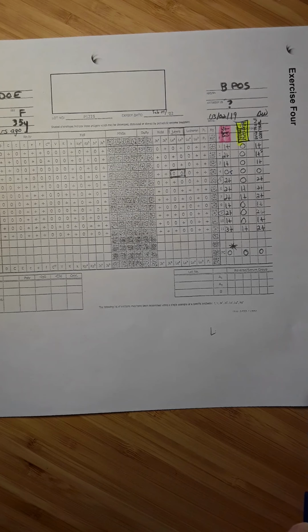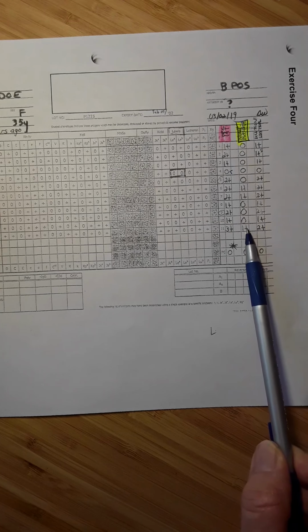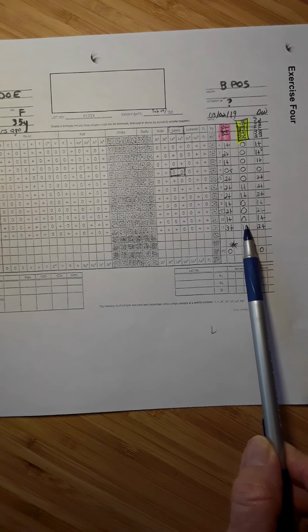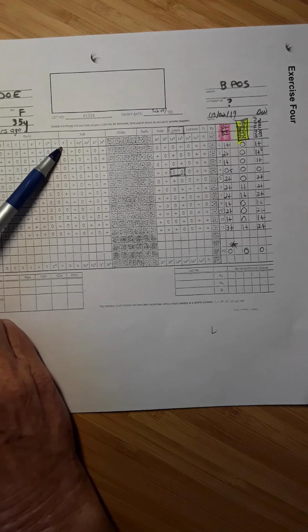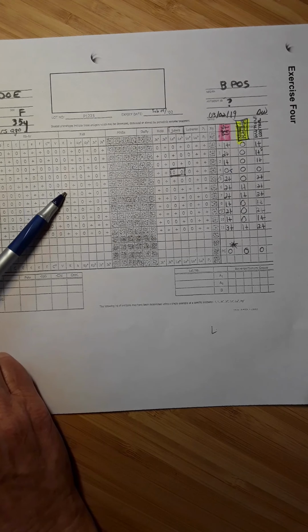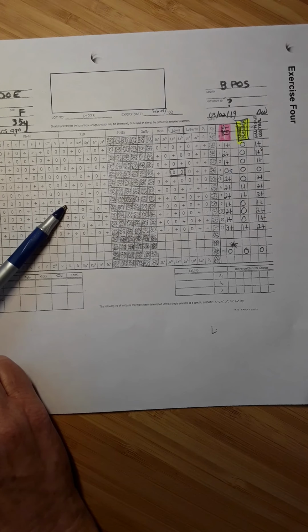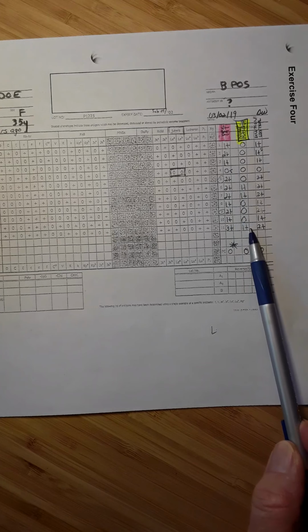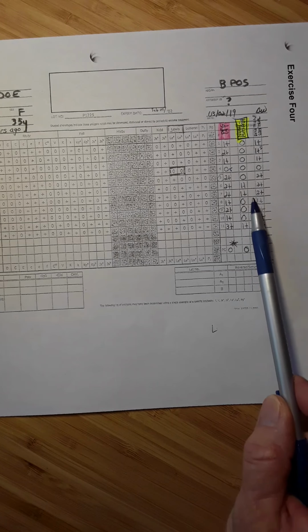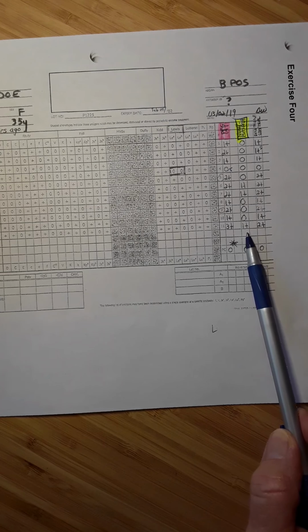So what I've said in the guided lesson plan is that this pattern matches what we would expect if the patient's plasma contained an anti-K. If we look down this big K column, we have a bunch of negative reactions. We have cells 6 and 7, which have the KEL antigen on them, cells 8, 9, and 10 that don't, and cell 11 that does have the K antigen on. Notice that those reactions mimic what we're seeing here, so that the patient's plasma is only reacting now with KEL positive cells, the big K positive cells.